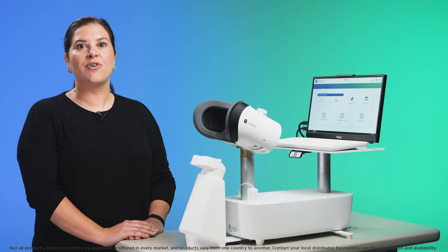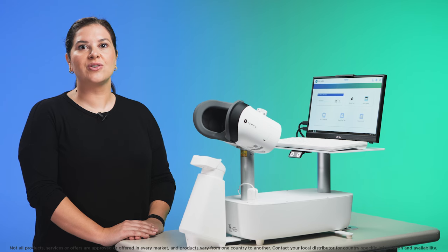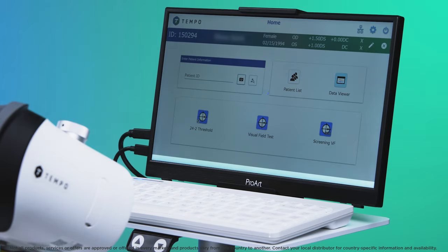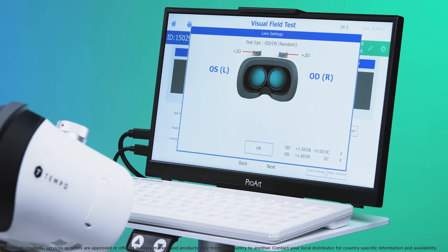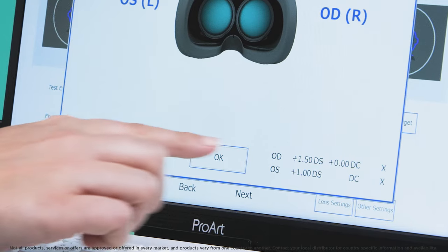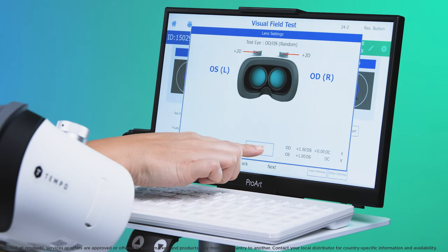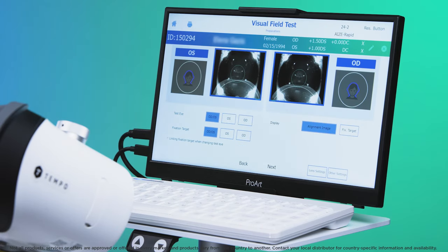To perform the 24-2 threshold test using the AIZE-Rapid algorithm, select 24-2 threshold on the main screen. Confirm the prescription is correct by pressing OK.